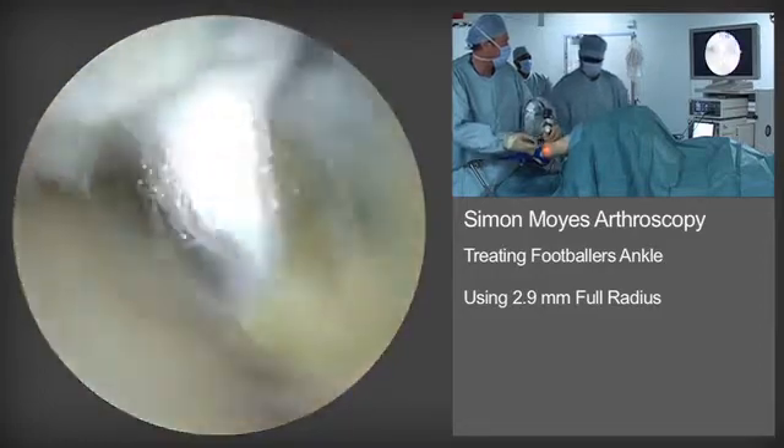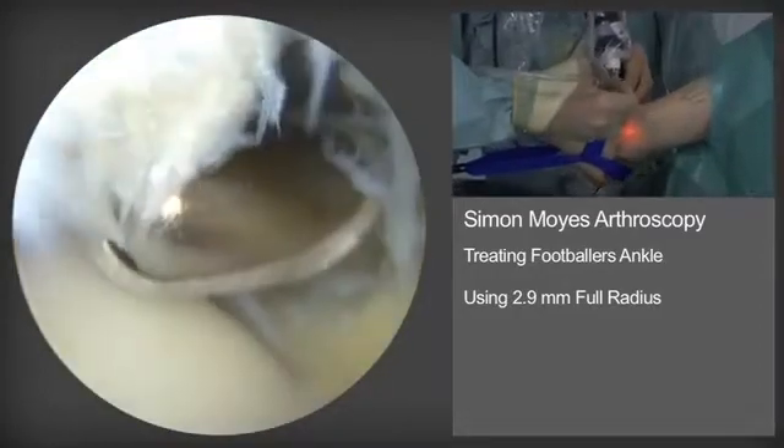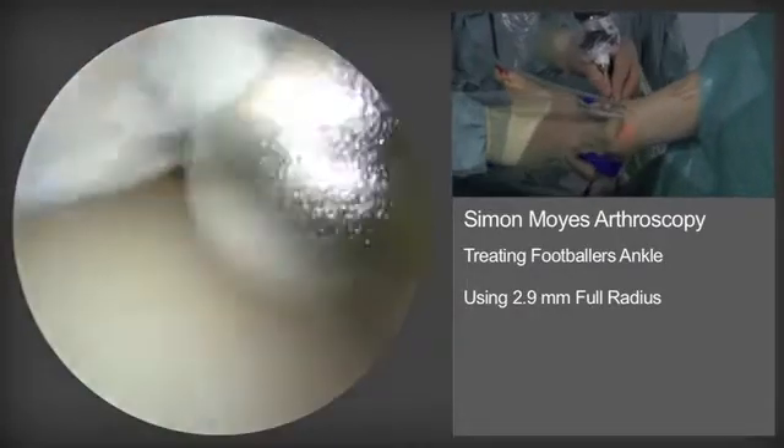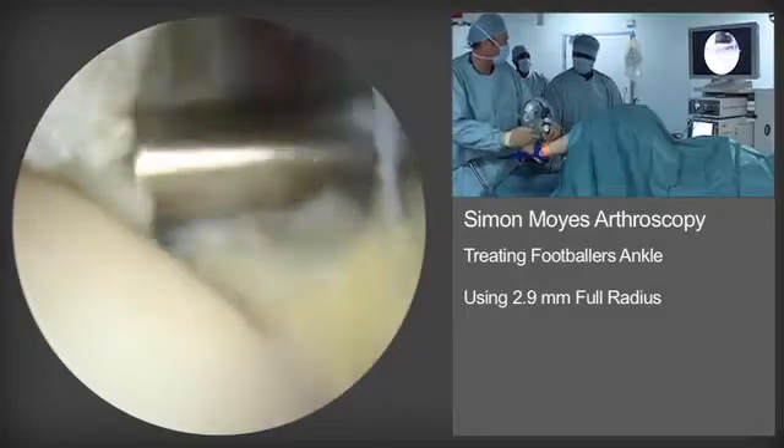It's noteworthy that the camera is placed anteromedially with the 30-degree scope viewing laterally, so one can view along the entire anterior border of the distal tibia.